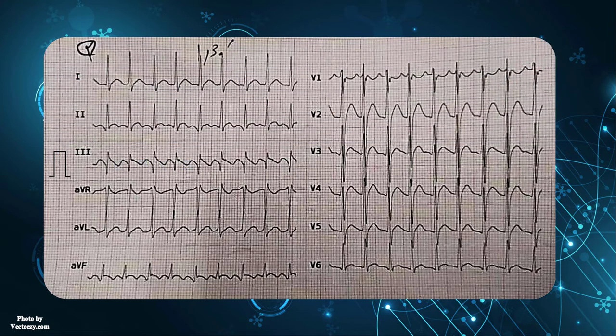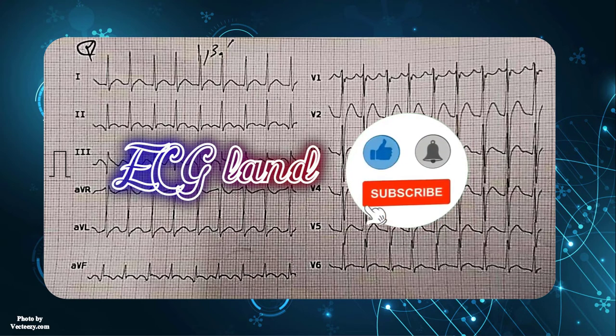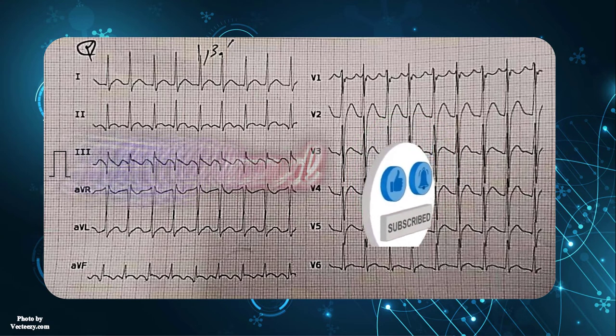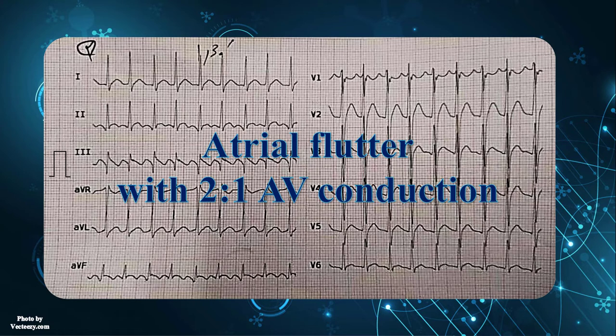The final step is overall interpretation. In order to interpret the EKG properly, we should make a list of abnormal findings. Atrial flutter at a rate of 166 beats per minute is the only abnormal finding in this strip.